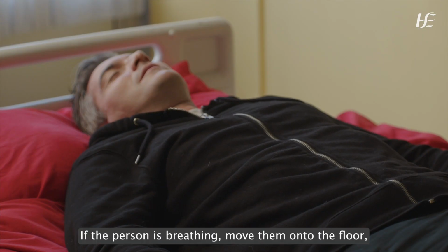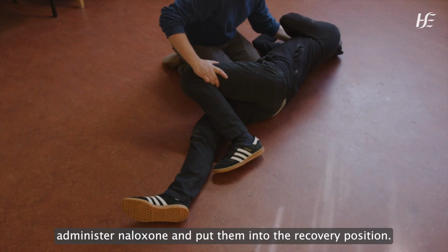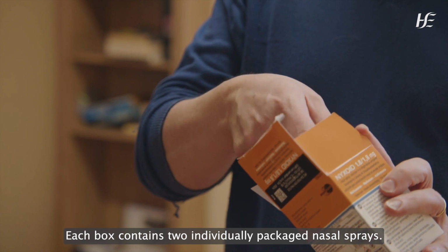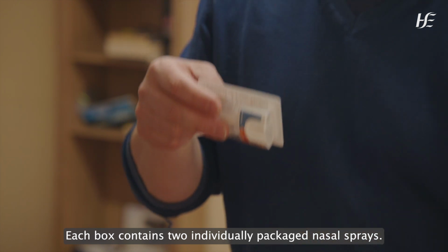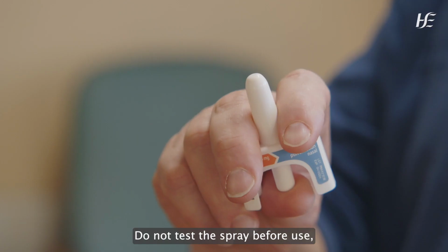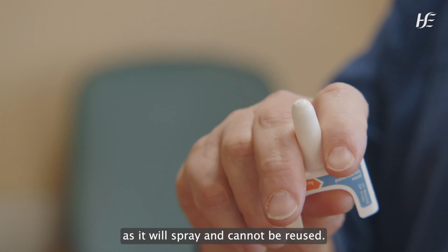If the person is breathing, move them onto the floor, administer naloxone and put them into the recovery position. Each box contains 2 individually packaged nasal sprays. Each spray contains 1 dose of naloxone. Do not test the spray before use, as it will spray and cannot be reused.